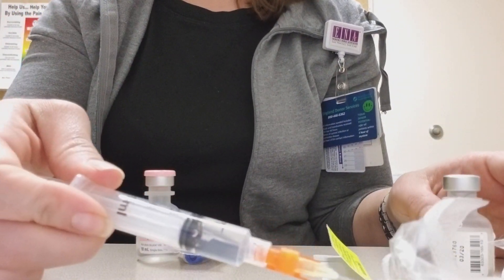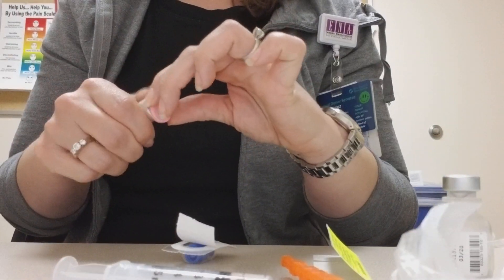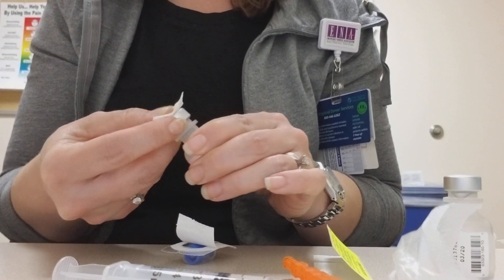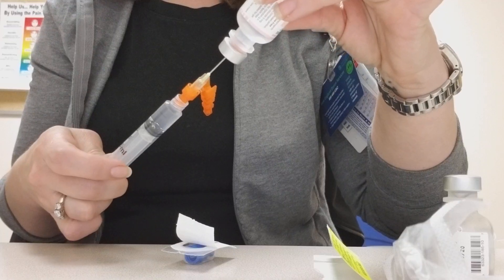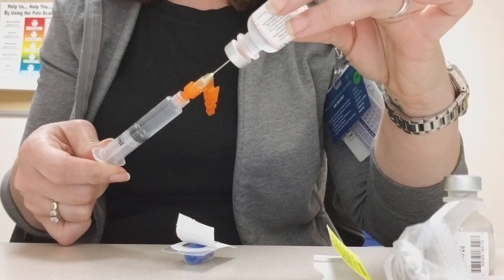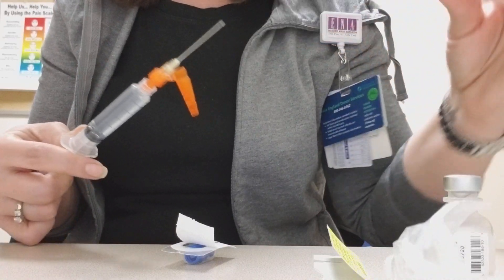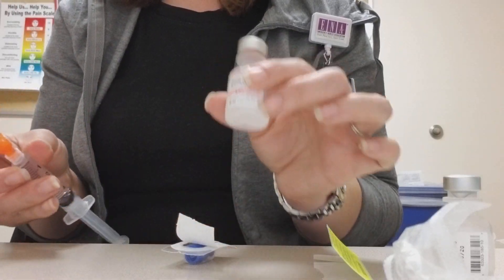Then we're going to pull up our saline. We use our vial at this point, and we're going to go ahead and grab another alcohol swab, clean the top of this, and then we can pull back our diluent. I've checked my resource — we have a new poster that will be in every medication prep room, and my resource tells me that fentanyl can be given undiluted or it can be diluted with normal saline up to five mls. So using that resource, I have five mls drawn up here.